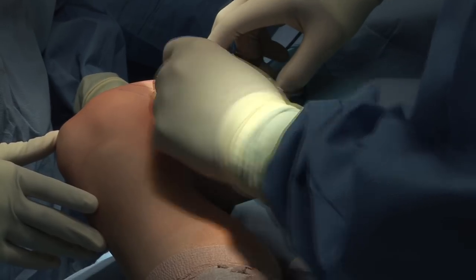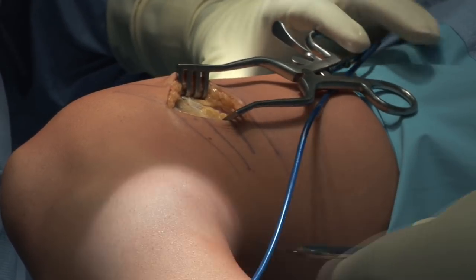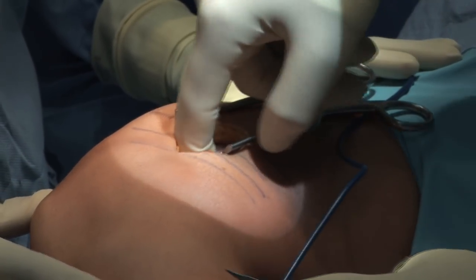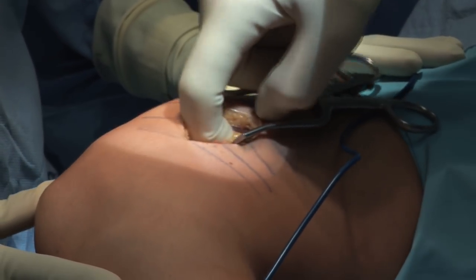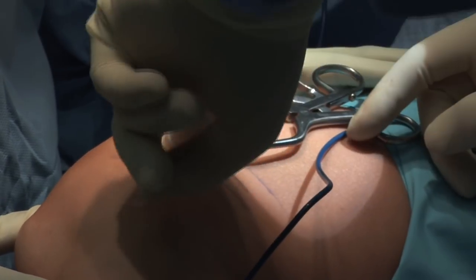The patient has been placed under general anesthesia, hip externally rotated, knee flexed. The approach to the osteochondroma is through the interval between the vastus medialis and semitendinosus. Digital dissection is done to locate the osteochondroma, which is just beneath the vastus medialis in this patient.